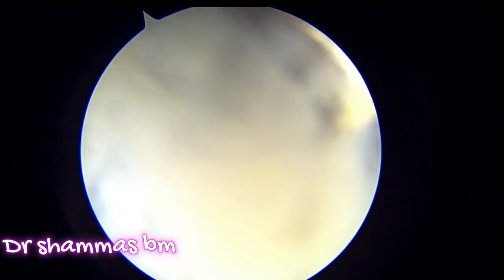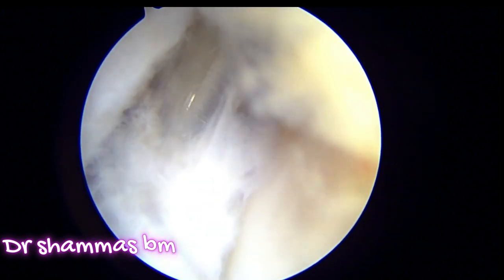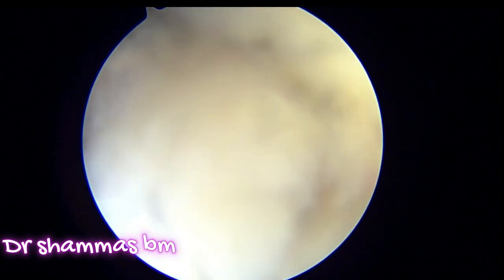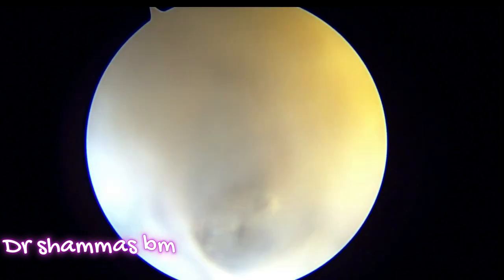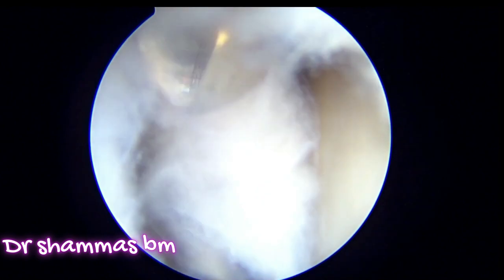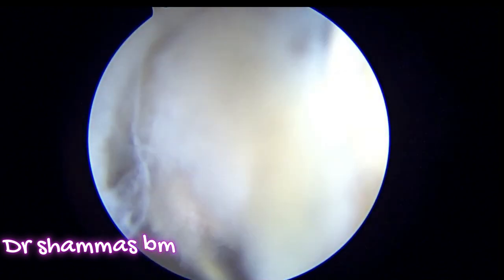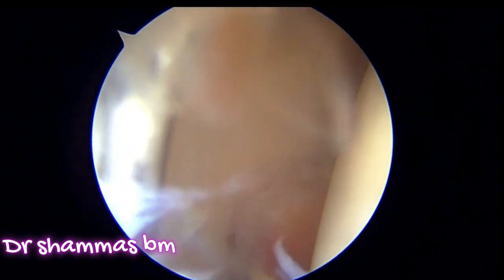Once you have the metal cannula inside, you are free to introduce any instrument you want. This is the most important step in hip arthroscopy. This instrument is a capsular cutting knife that has come inside, and with this knife we have to cut the capsule from the anterior portal to the anterolateral portal. After cutting it, you can see that the joint is wide open. You should be very careful not to injure the cartilage or the labrum because both sides of this knife are sharp.